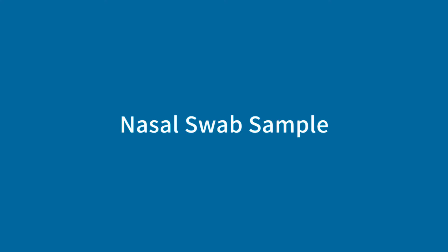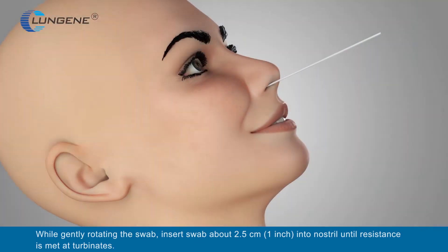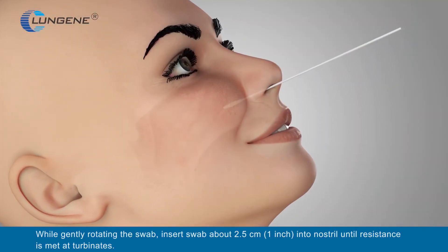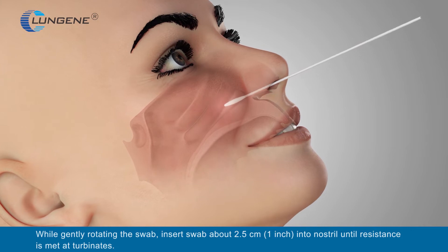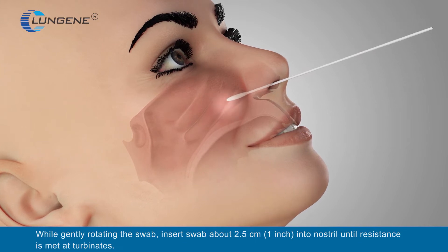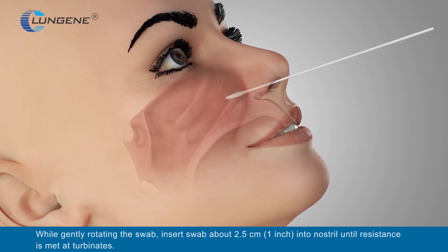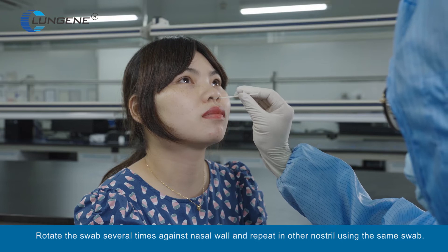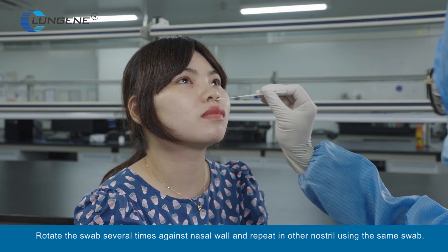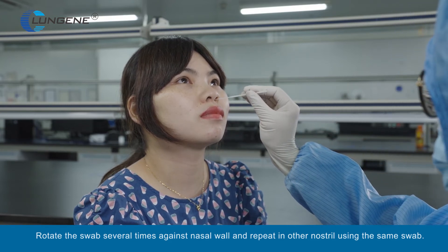Nasal Swab Sample. While gently rotating the swab, insert it about 2.5 cm (1 inch) into the nostril until resistance is met at the turbinates. Rotate the swab several times against the nasal wall and repeat in the other nostril using the same swab.